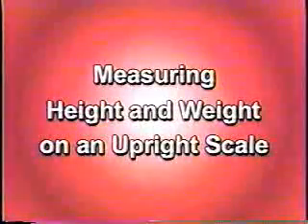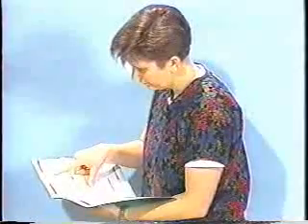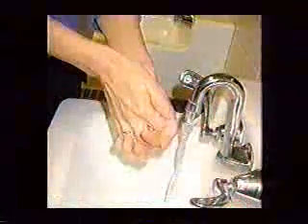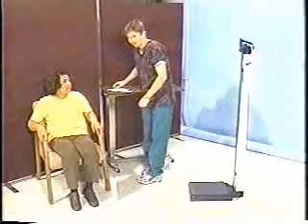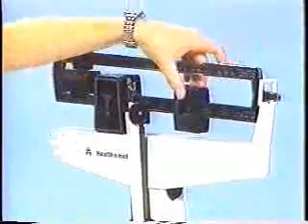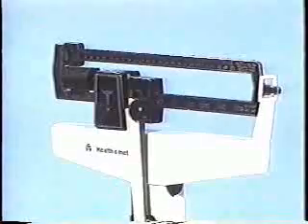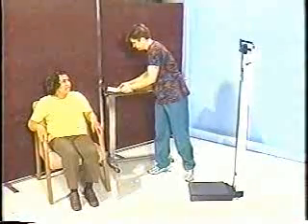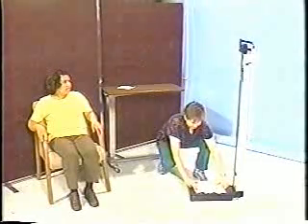Measuring height and weight on an upright scale. Ascertain the previous weight, type of scale used, and the time the patient was weighed. Wash your hands. Balance the scale. Place the large weight and the small weight indicators at 0. The balance bar should be balanced in the center. If not, use the balance adjustment to bring the scale to balance. Place a paper towel on the platform.